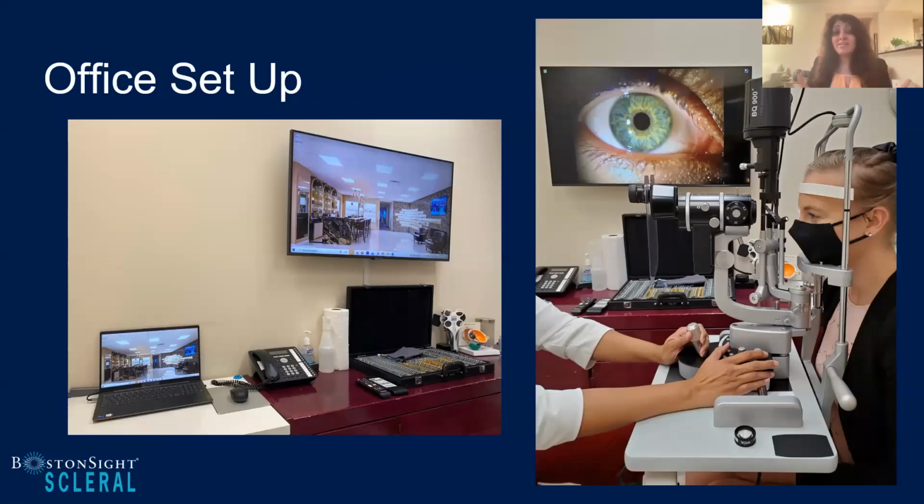And then I can take the whole device away, the slit lamp away, and show the patient. And when you talked about education, it's the most important thing that we do on a daily basis, is we are educating and teaching our patients about what we're doing for them. And the more that we can show them, the easier it is for us to be able to explain what it is that we're doing and why we want the things that we want them to do.